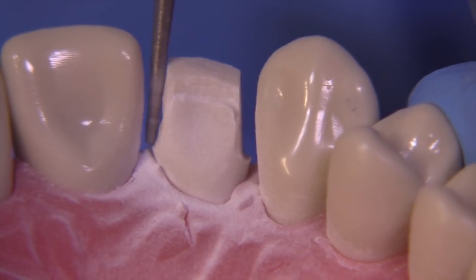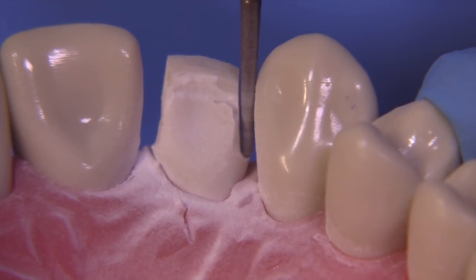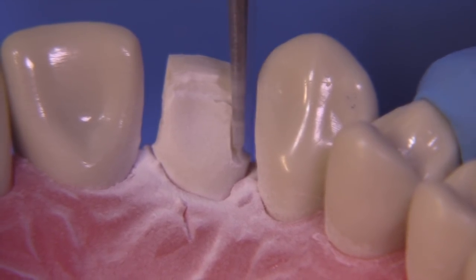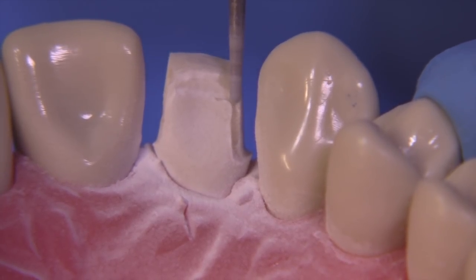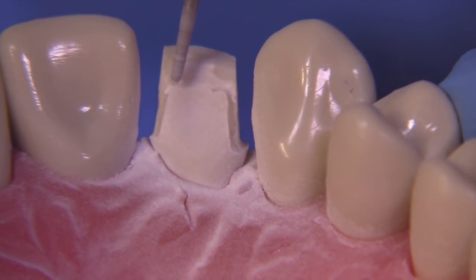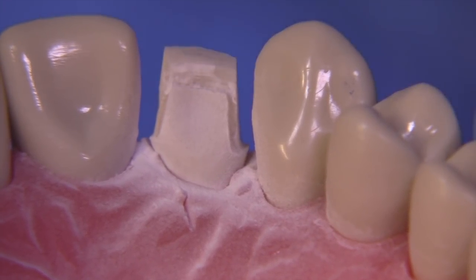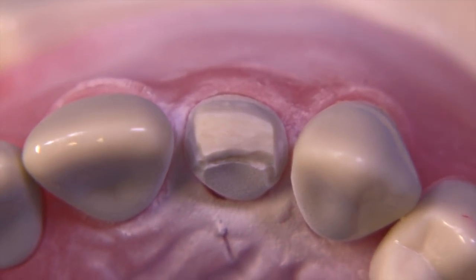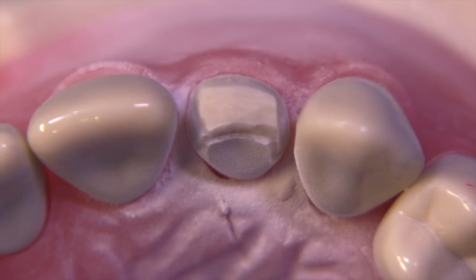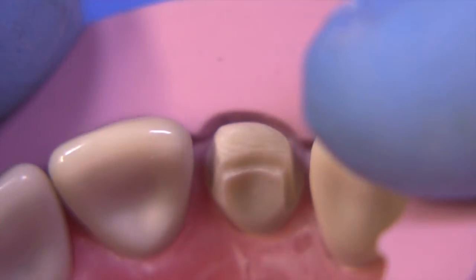This vertical wall should be about 1.5 to 2 millimeters and it's going to provide a significant amount of resistance form for this e.max veneer. Remember, super veneers are indicated when you have less enamel, when you have margins on the facial that are on the root surface, and when we need more retention through conventional means to hold this in place — it's a little bit like a reverse three-quarter crown, all-ceramic. You could also use the football-shaped diamonds from the burr kit for this same purpose. There's always a point where the preparation looks ugly and you've made mistakes; now it's time to correct those line angles on the mesial and distal.